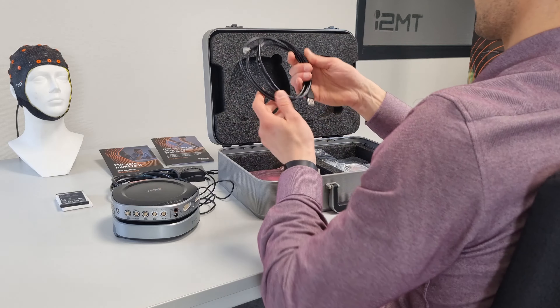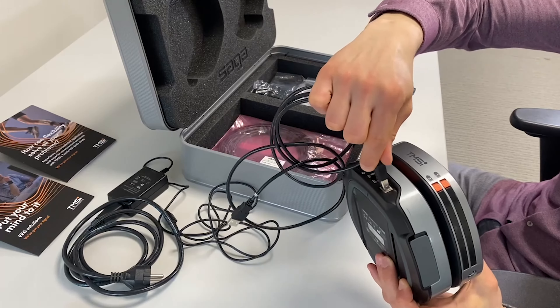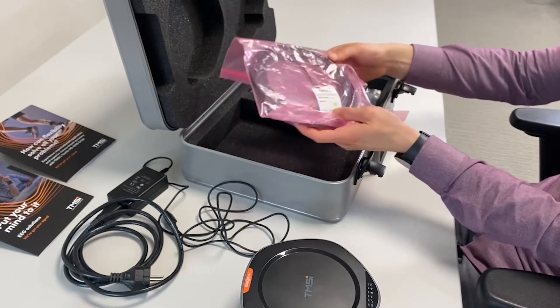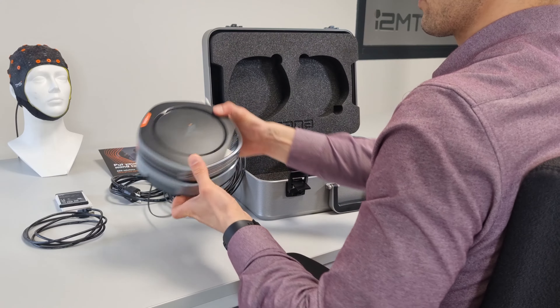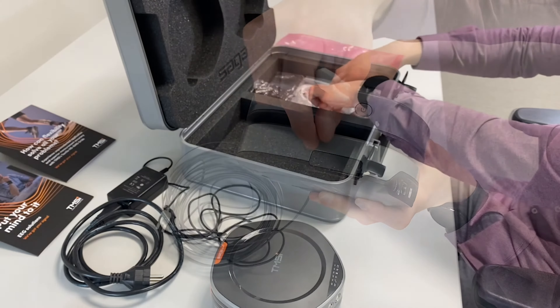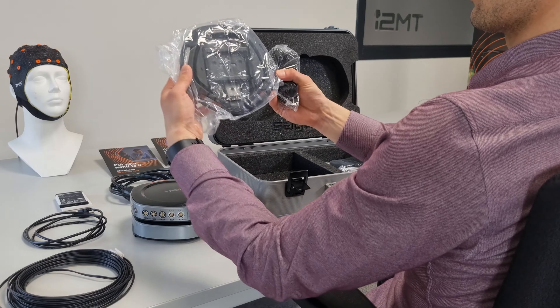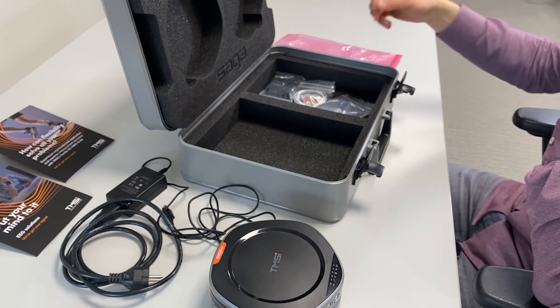The USB cable connects Saga to the PC and should be inserted in the docking station and to the USB ports on your PC. The optical fiber cable can be used for mobile measurements and can be connected to the docking station and on the data recorder. Additionally, a bracket with straps to mount the data recorder is provided for portable measurements, and the length of the strap can be adjusted for every subject.